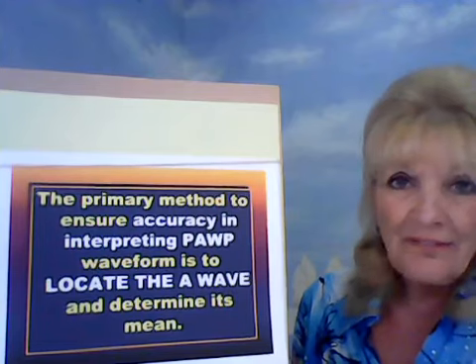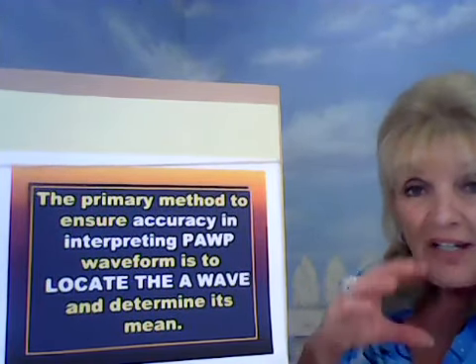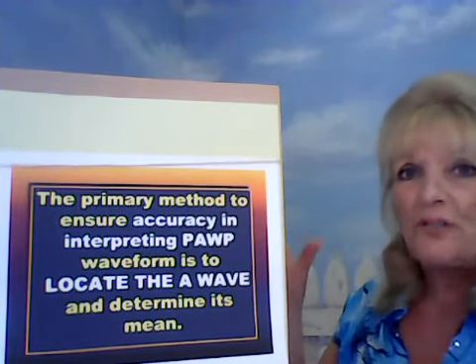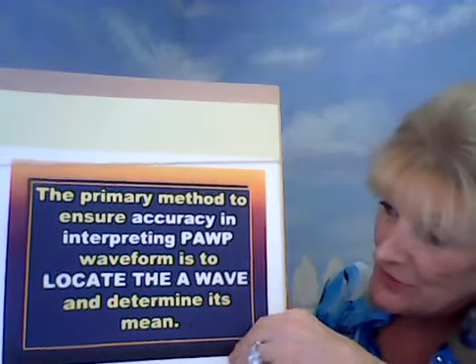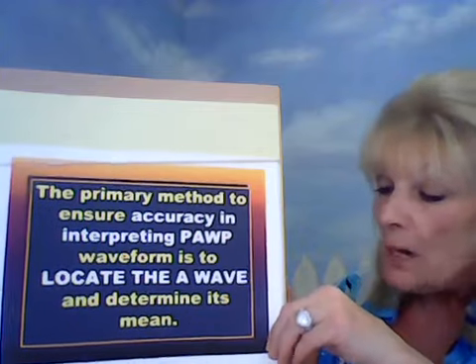The machine does not give you an accurate number because it averages out the height of all the humps on the screen in a given frame. And so it's not accurate. So let me tell you how to get an accurate wedge, the number.